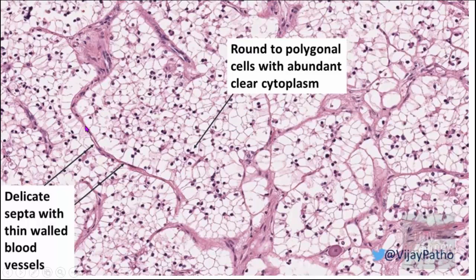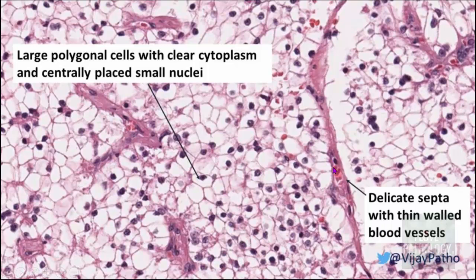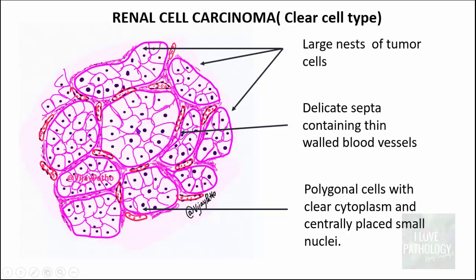At high magnification, these tumor cells are round to polygonal with abundant clear cytoplasm — the cytoplasm appears clear because all lipid and glycogen content is washed out during routine tissue processing. The cells have centrally placed nuclei. The septa are delicate and thin, containing capillaries filled with a few RBCs. For your illustration, draw clusters of large polygonal tumor cells in nests separated by delicate septa containing blood vessels. This is a straightforward slide to diagnose and illustrate.